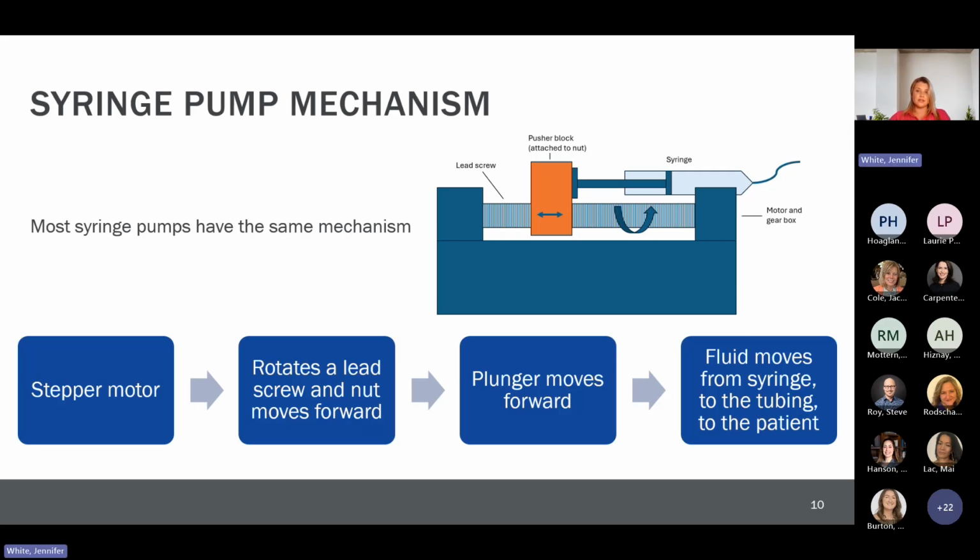At low programmed fluid rates, it will take a while for the gears to engage, and that lead screw is going to turn slowly, and it will therefore take more time for the fluids or medication to reach your patient, especially if the tubing has not been primed on the pump. At higher programmed rates, the engagement occurs much quicker. Let's take a look at how this affects flow continuity.